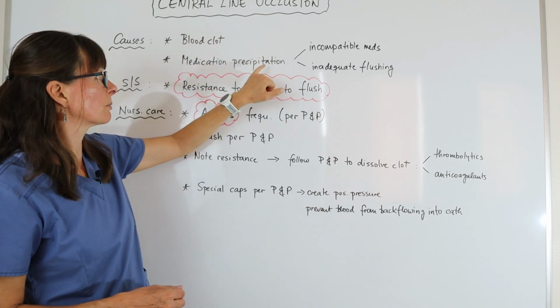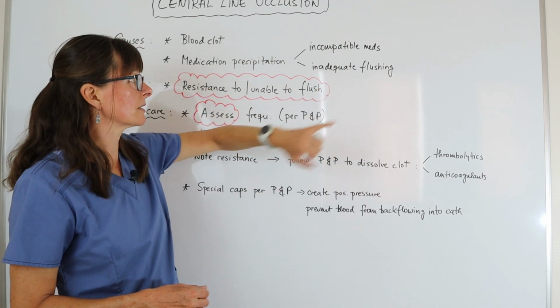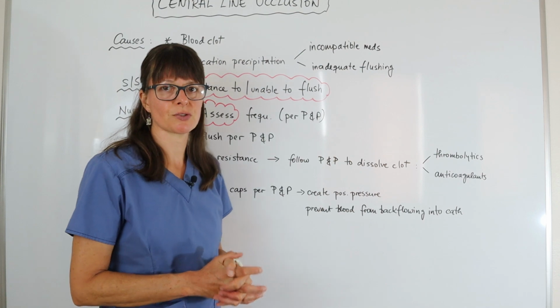Of course, we need to still be sure that we don't administer incompatible medication and adequately flush the lines as per the policies and procedures.